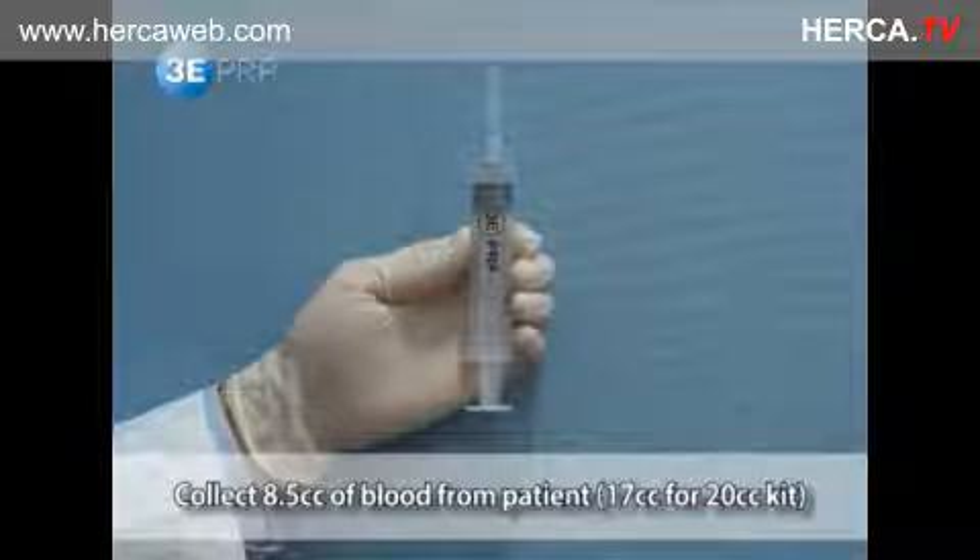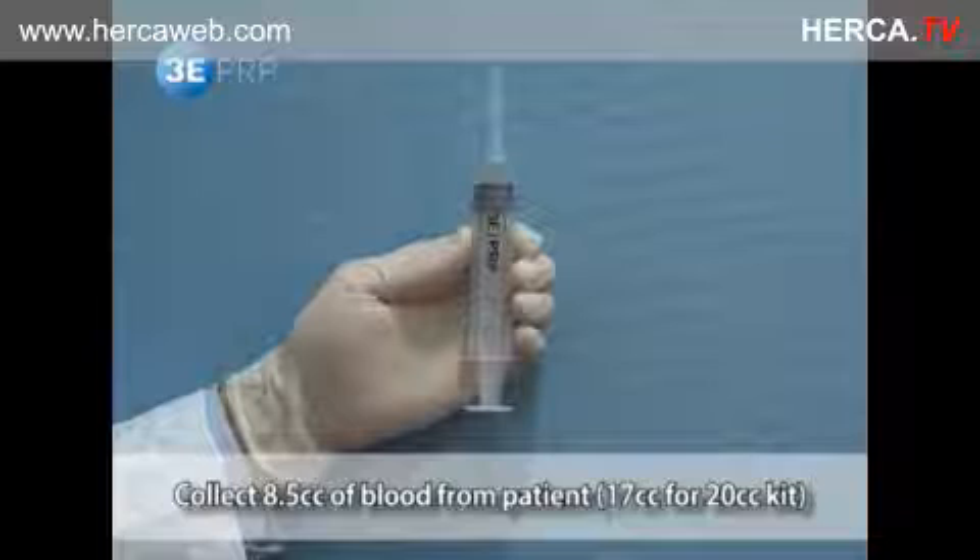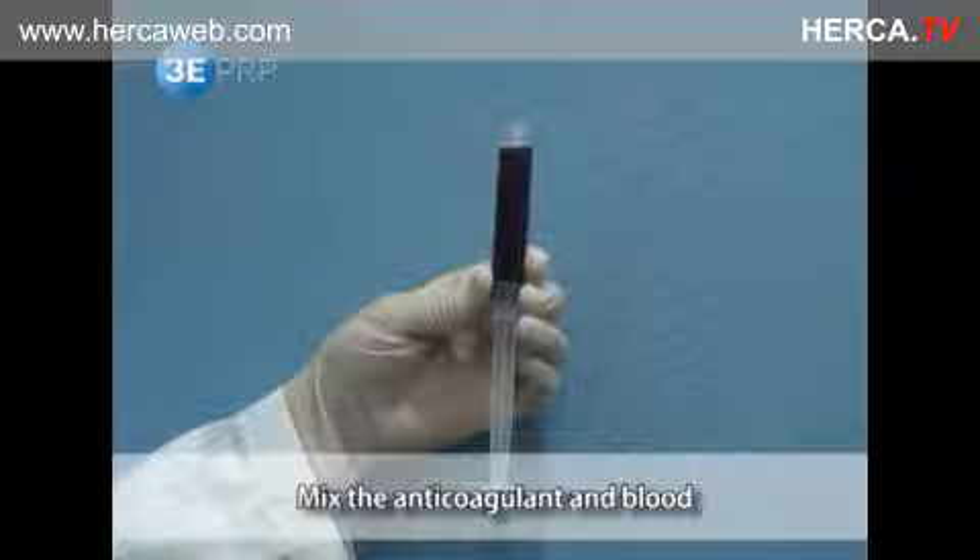Replace the needle and collect 8.5cc of blood from the patient. Remove the needle and seal the entrance with the cap.